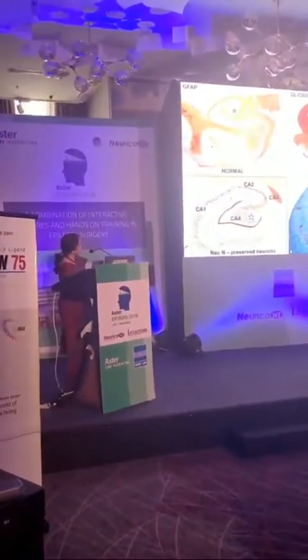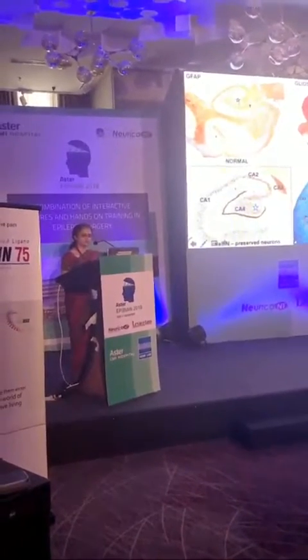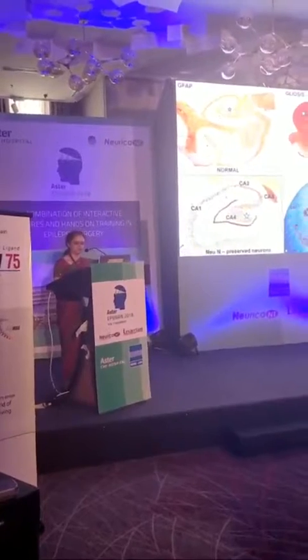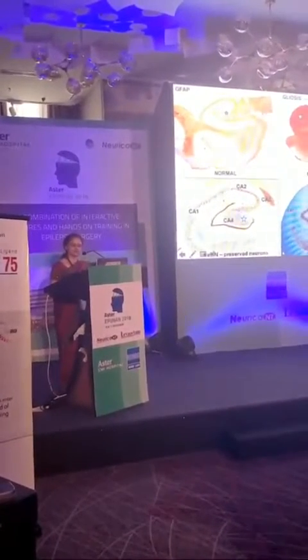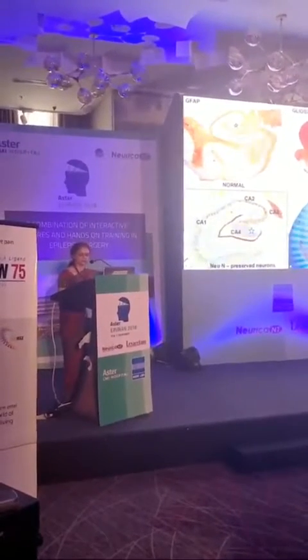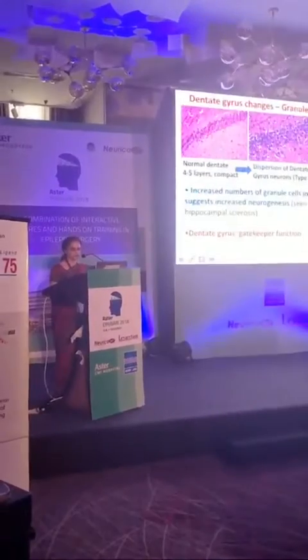What you're looking at here is a normal hippocampus, with a GFAP stain, which tells you the amount of glial distribution that you see. Versus this, a sclerotic hippocampus. All that brown tells you there is intense gliosis. So these are the two changes that I've already alluded to, neuronal loss and gliosis.